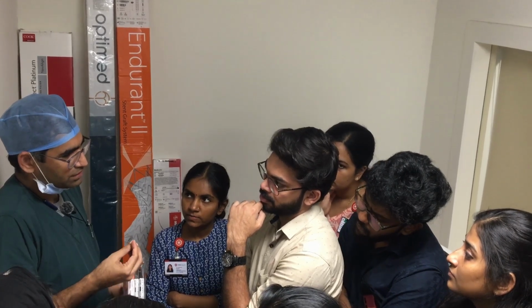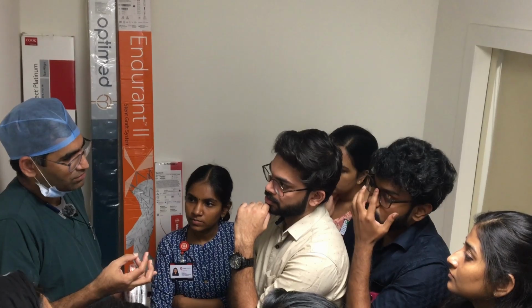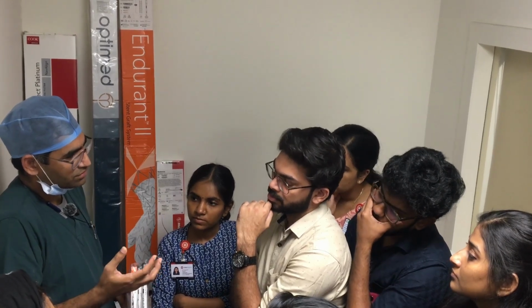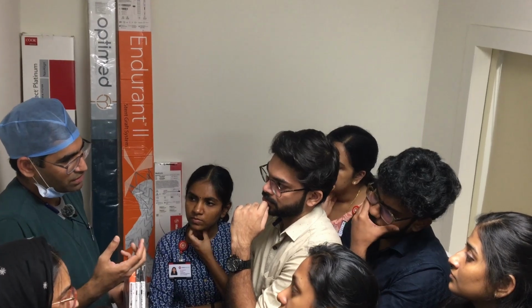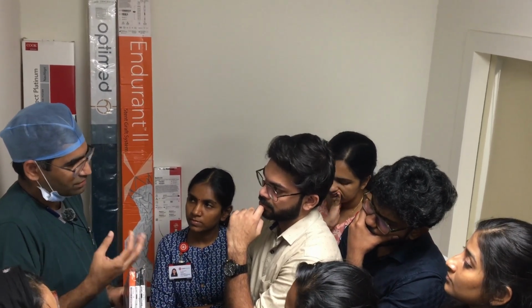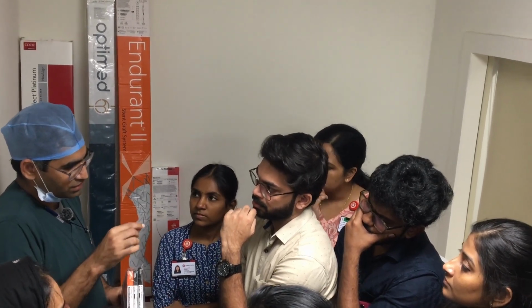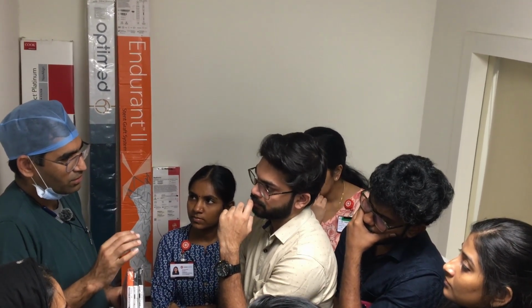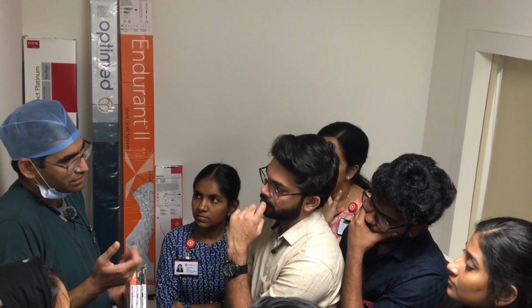When we do angioplasty, one thing is we have to open the vessel. Second thing is we have to keep it open for longer. So how long can we keep it open? The best outcome to keep the vessel open for long is intraluminal. If the wire goes purely inside the lumen, then it has the best long-term patency.